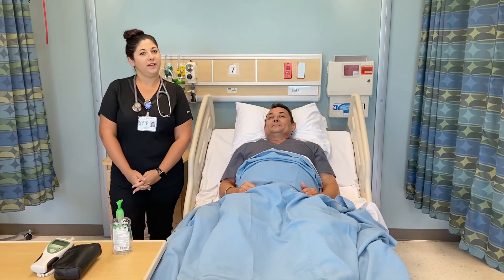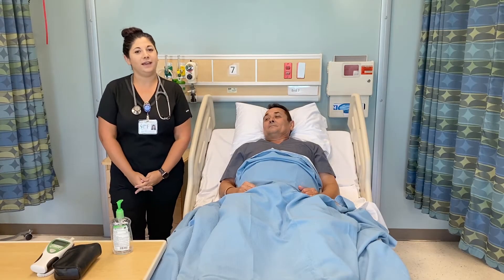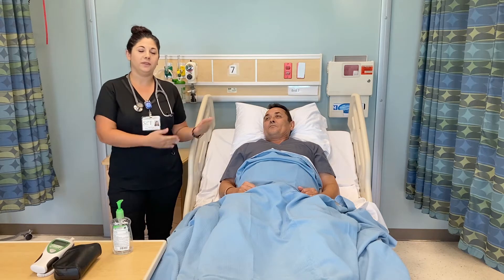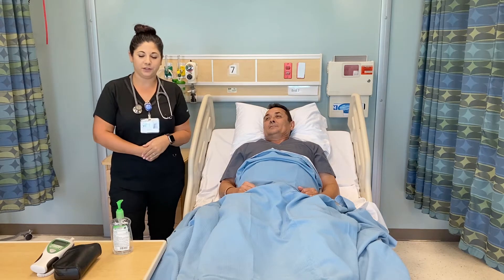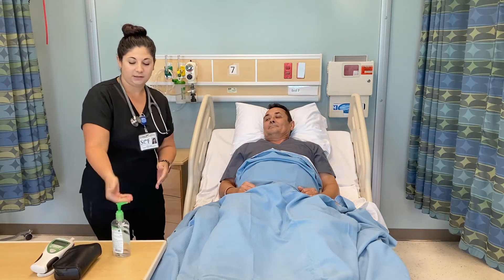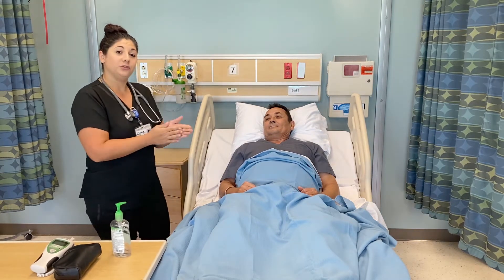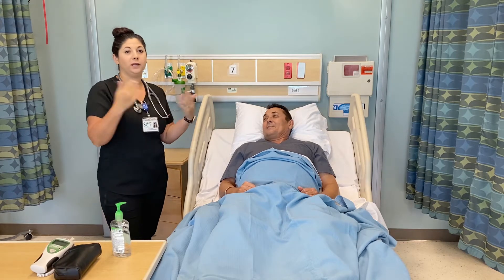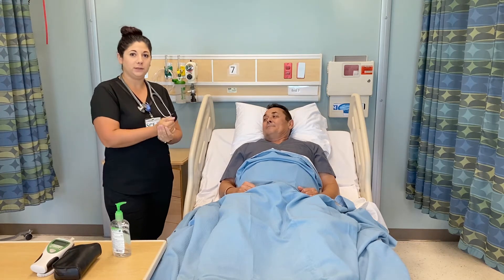Today we are starting with vital signs. I have knocked on my patient's room and they've allowed me to enter. I am washing my hands and introducing myself, explaining what we will be doing today.